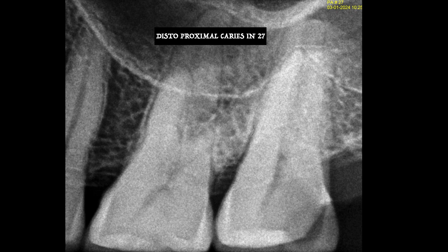I'm going to share that with you because each case had unique anatomy and also some interesting learning objectives, and that's why I made this post. This is the first patient, which is a left maxillary second molar with a distoproximal caries, and what could be challenging here is to achieve isolation throughout the procedure.